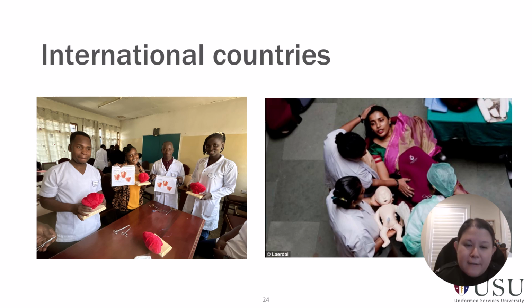You can kind of tie off the uterine arteries and try to stem the bleeding that way. But in really refractory cases of postpartum hemorrhage due to atony, there's also uterine compression sutures. And so they were not very familiar with this technique. And I was like, hey, while you're waiting to do your hysterectomy, we can learn how to do a suture.